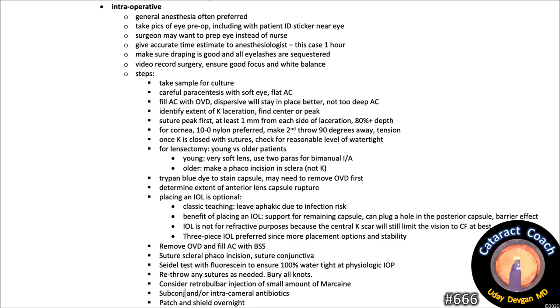Remove the viscoelastic and fill the anterior chamber with BSS. Suture the sclerotunnel phaco incision and suture the conjunctiva. Perform a Seidel test on everything with fluorescein to ensure 100% watertightness at physiologic IOP. Re-throw any sutures as needed and bury all knots. Consider a retrobulbar injection of a small amount of Marcaine or Bupivacaine for long-acting local anesthesia. Subconjunctival or intracameral antibiotics, then patch and shield overnight.